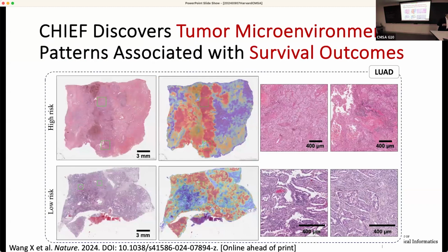And we further identify the regions related to those occupied by our high attention regions. And we show that those are largely related to dense clusters of cancer cells, which also align with our prior biological knowledge.